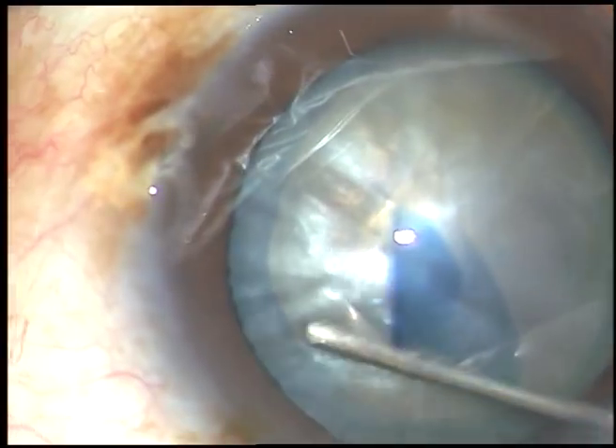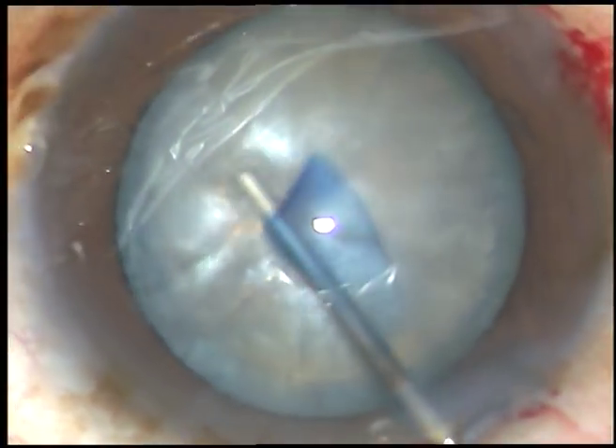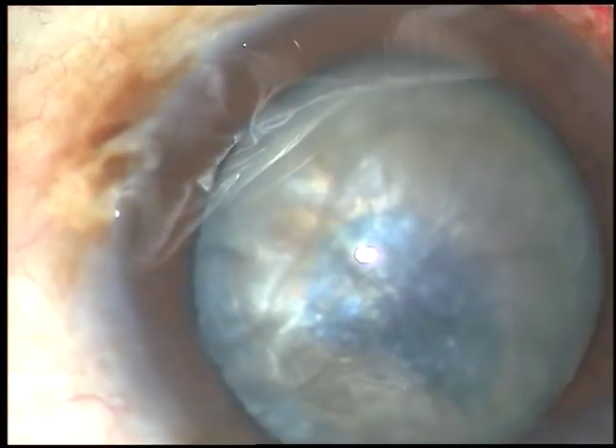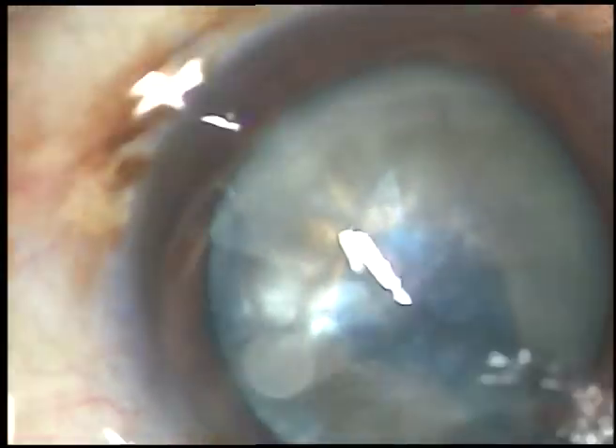A little bit of hydrodissection is done. Viscoelastic substance is injected again. And now I am going to introduce the tip of the phaco handpiece.